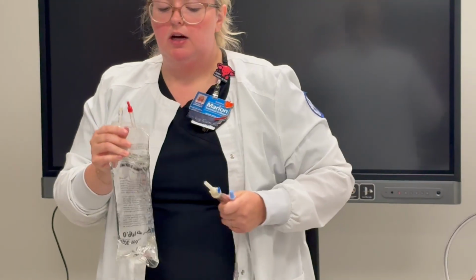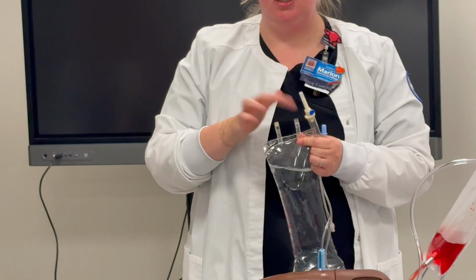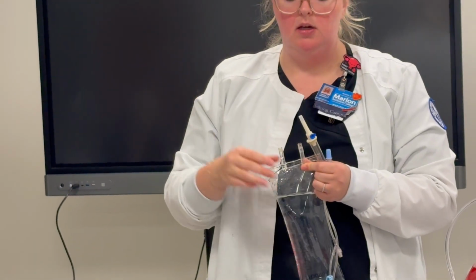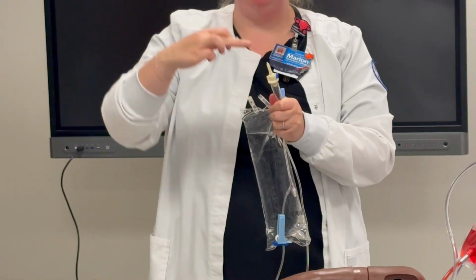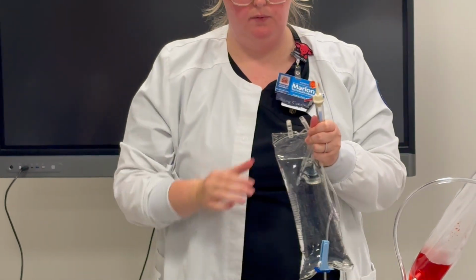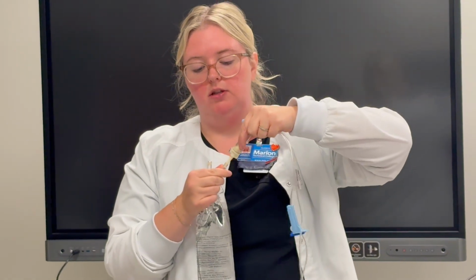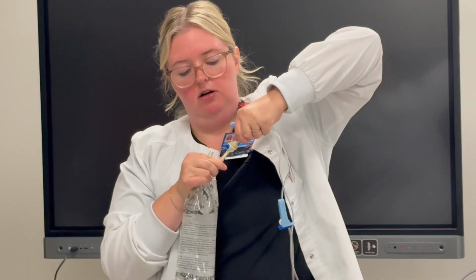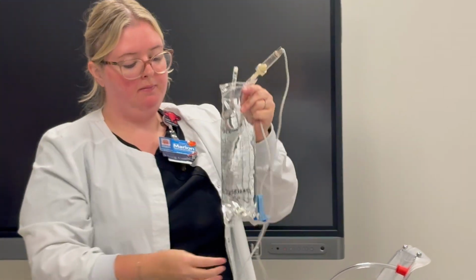This is where you kind of have to figure out what works best for you, because can I take this off and start touching this? No. So I hold it, I kind of pinch it like this. I take this cap off. Can I touch that? No. So looking at both ends, being gentle and slow, you're gonna spike and it's harder than you think. So you're gonna twist until it goes, there's like a little ridge on there, okay?